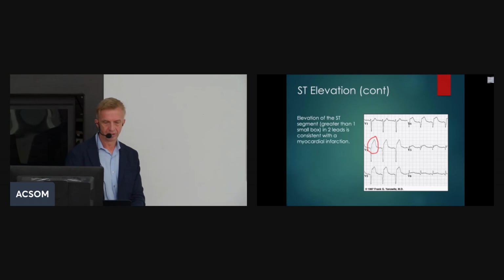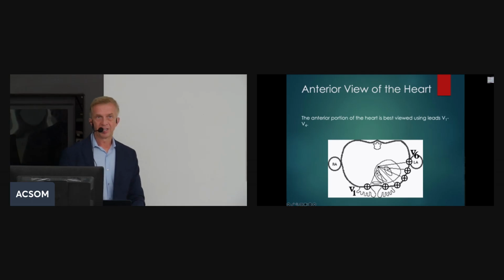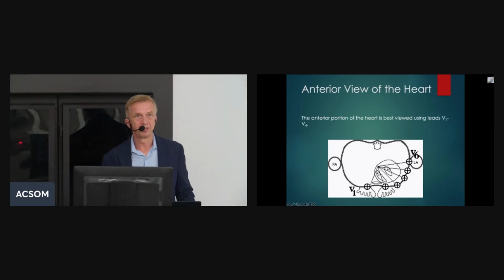So remember, acute infarct: ST segment elevation or ST segment depression of more than 1 millimeter in 2 consecutive leads. There are other criteria that we assess, but this is the most common. I'm going to stop here because we don't have enough time for the rest of the slides. So this was just the basic EKGs. We can talk about the rest and how we assess in the small group session.